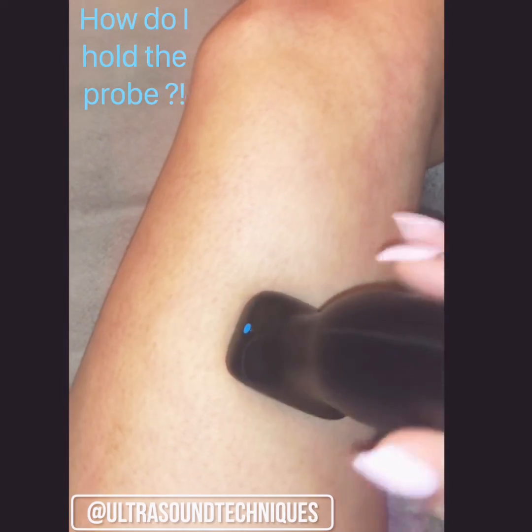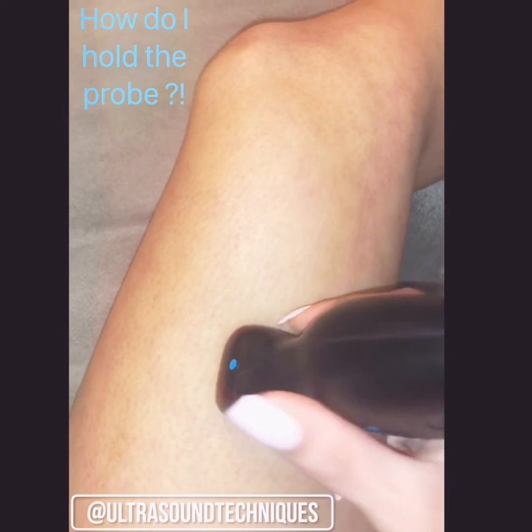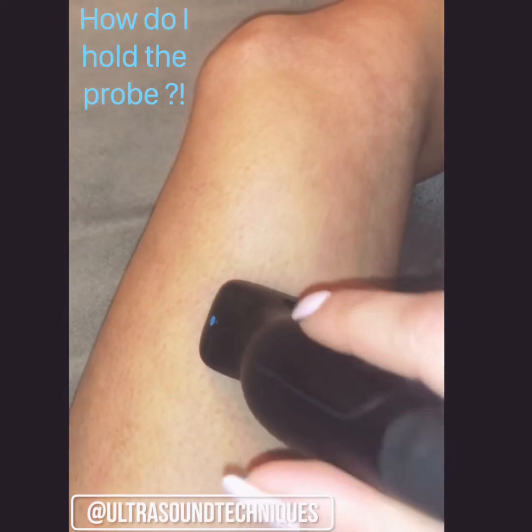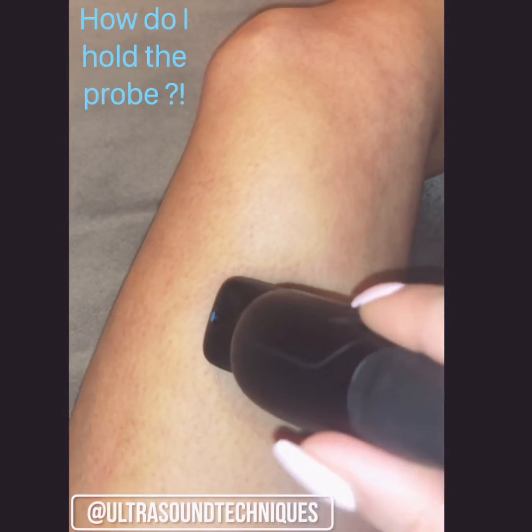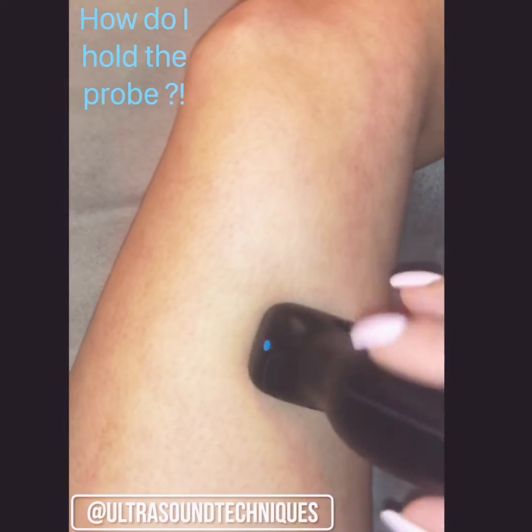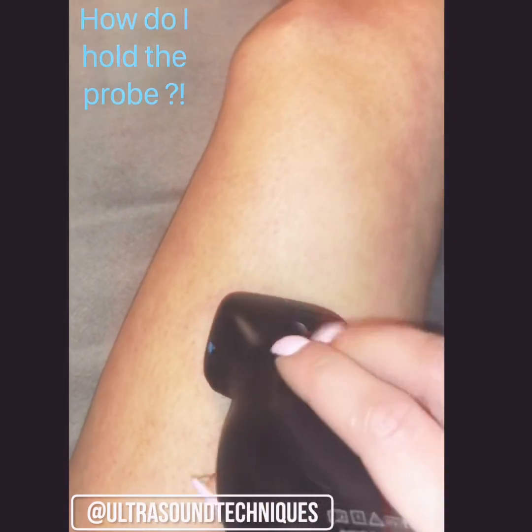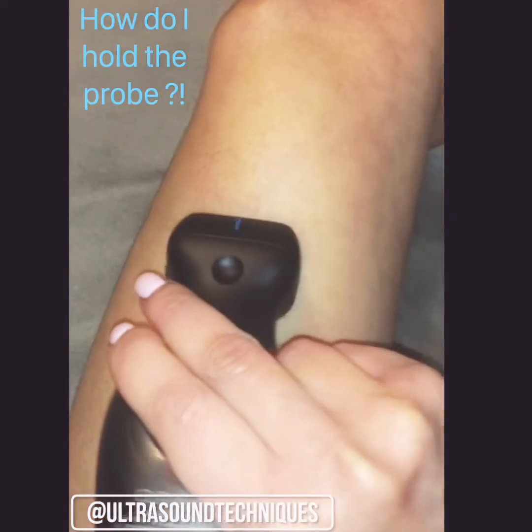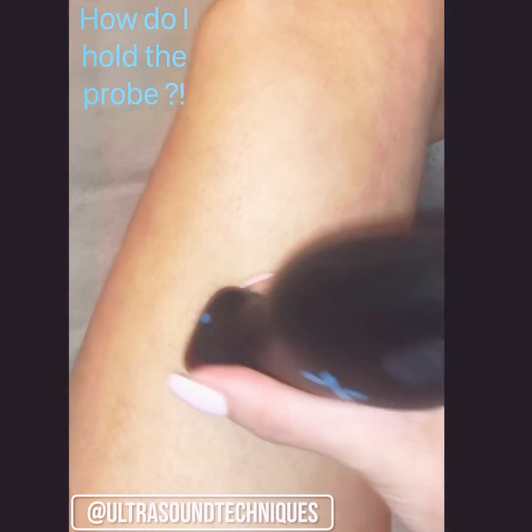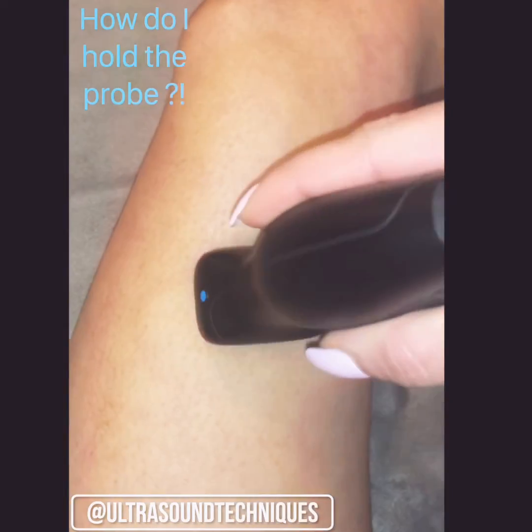For example, some techs hold it like a pencil, a little bit further down. You can even hold it a little bit further up, especially if you're assisting in a biopsy — you don't want to be too close to the needle and you want to give the doctor some room. So you can hold it up here, with all four fingers, in between the second finger, or a little bit lower.